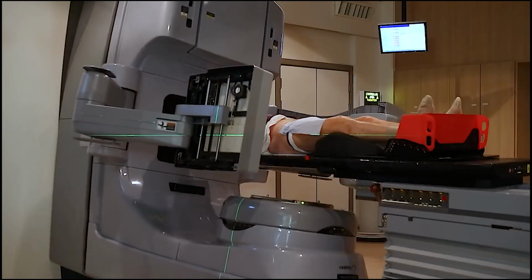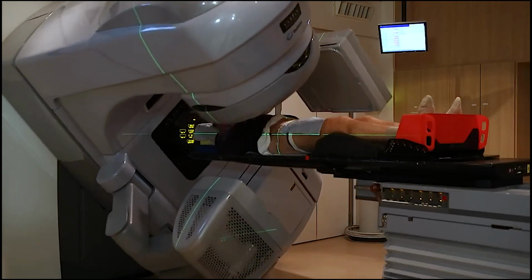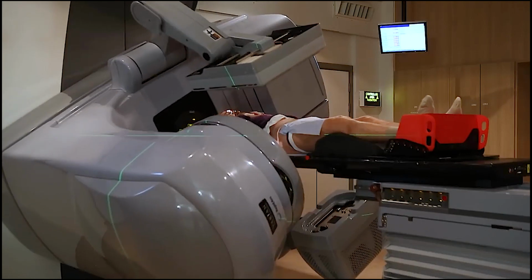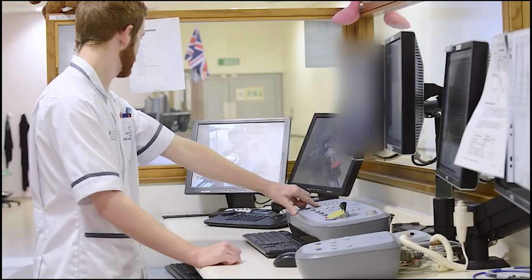So you need to be in the treatment position for approximately 15 minutes. However, the actual treatment will last approximately 2 minutes. This treatment itself is absolutely painless. You won't feel or sense anything. You may hear some buzzing noise as the treatment gets delivered. Apart from that, you wouldn't notice anything. The treatment time as well as treatment dose remain exactly the same throughout your course of treatment. There is no change in that. From day one till the end of your treatment, the same amount of treatment dose as well as the same amount of treatment time will be taken.